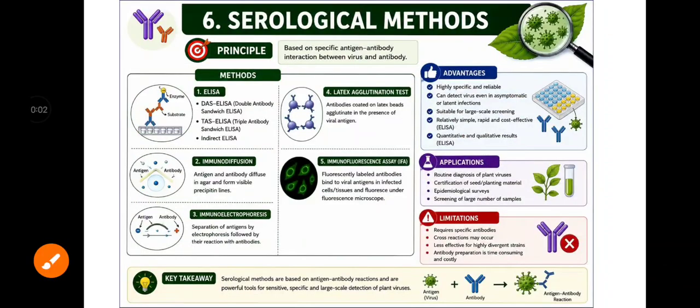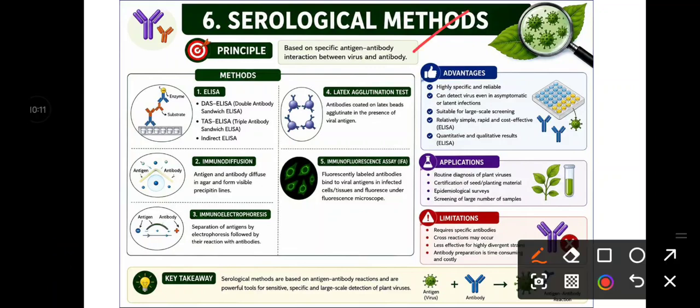Next, about the serological method. Serology, everybody knows, is based on the specific antibody and antigen reaction. That is the principle behind this.